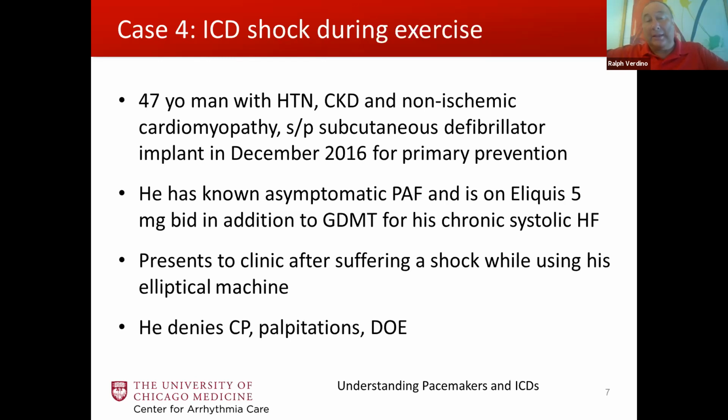And if you're implanting a device, it's kind of nice to have a relatively high impedance, because you'll use a bit less energy, a bit less battery, if you will, by pacing with a high impedance lead. Great point, Ralph.